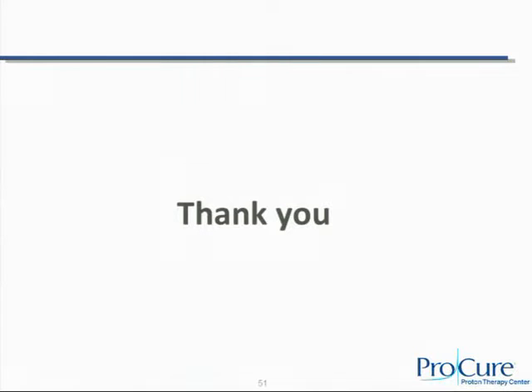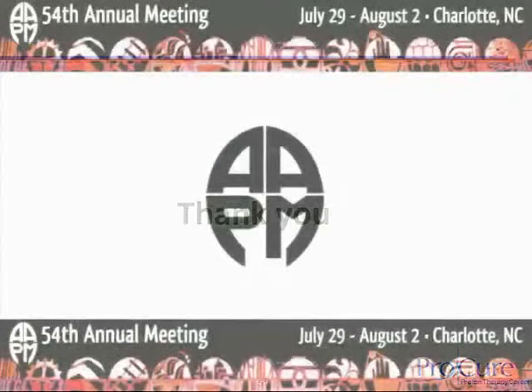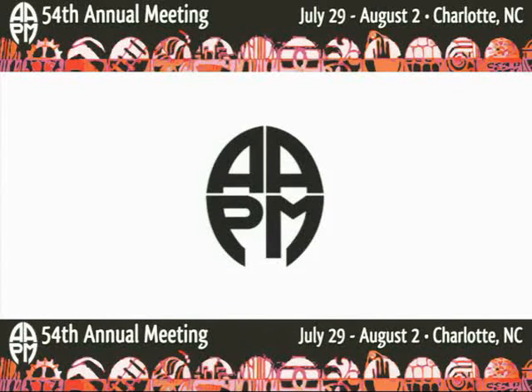Omar, thanks for a wonderful introduction to the field. I'm wondering, since you're adapting devices like the Daily QA3 and the Profiler, which were originally designed for photons and electrons, do you see anything that you might attribute to particle damage or activation that's different from the cases that you would see with photons and electrons?